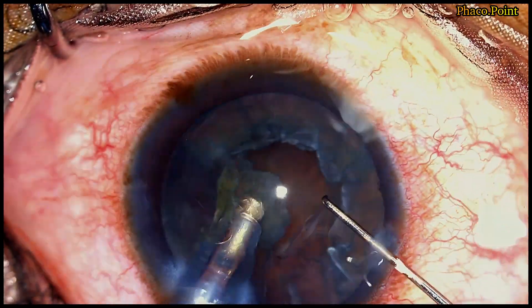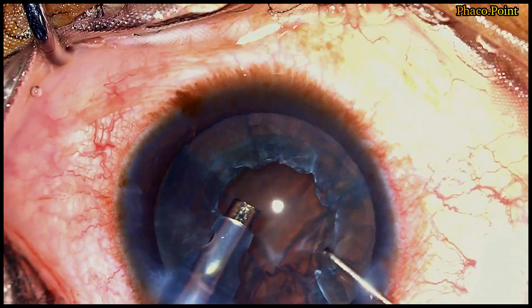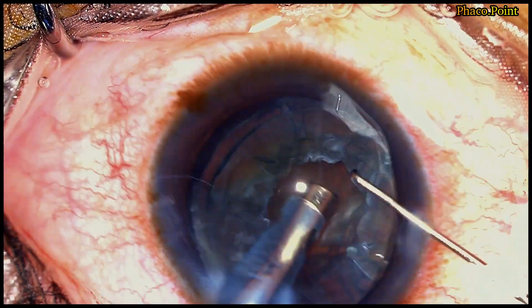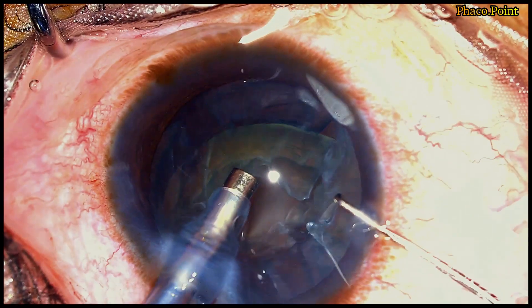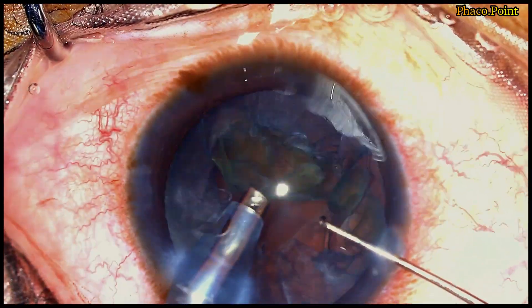In this particular case, it was an unusually soft cataract, so I divided it into only three fragments. Following the completion of nucleus removal, there is a significantly large epinucleus which is then aspirated.